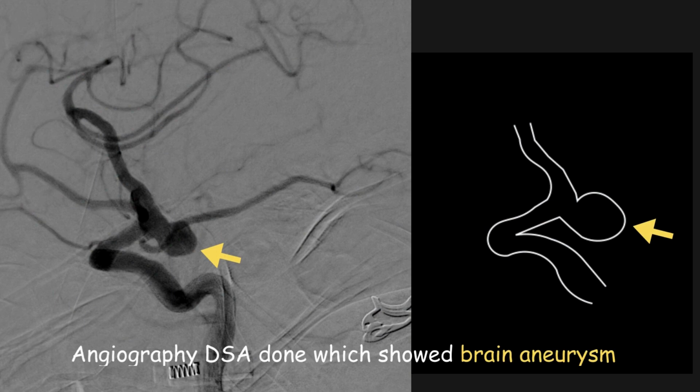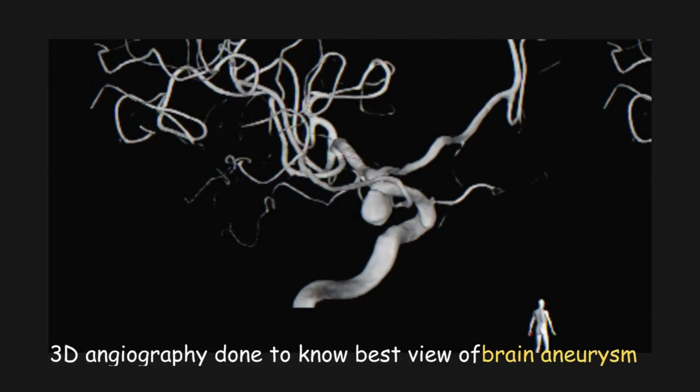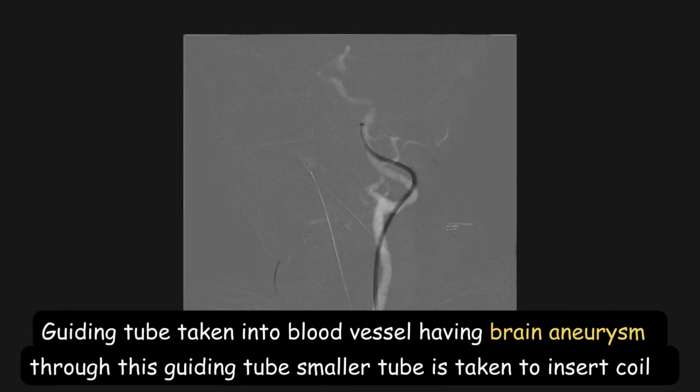Angiography was done which showed the brain aneurysm, as shown by the arrow. Now 3D angiography was done to know the best view of the brain aneurysm. A guiding tube is taken into the blood vessel which has the brain aneurysm. Through this guiding tube, a smaller tube will be taken to insert the coil.